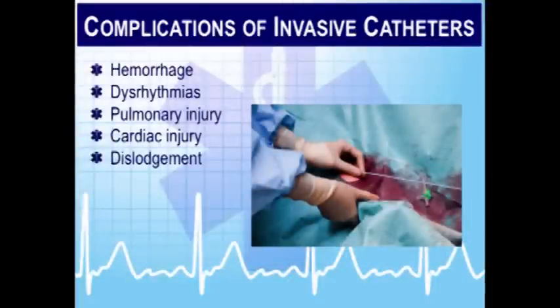That catheter that we put into the heart, or even a central line, if it's in too far, can cause dysrhythmias. So it can be the cause of why the patient's in VTAC right now. It can cause pulmonary injury. The Swan catheter that I'll show you when we get there sits all the way in the pulmonary artery. It has a balloon on the end of it. That can cause rupture of the pulmonary artery, and you can die when that happens. You oftentimes do die when that happens. It can cause cardiac injury.